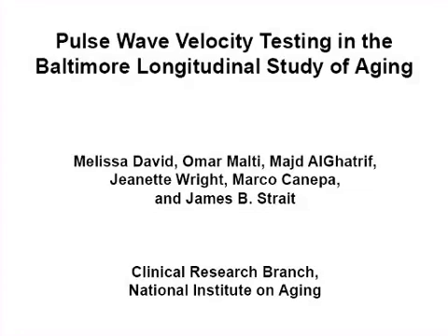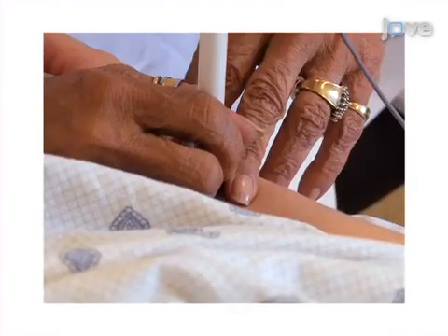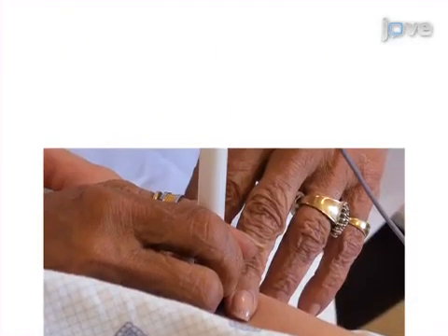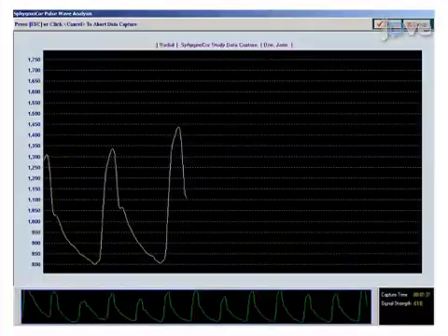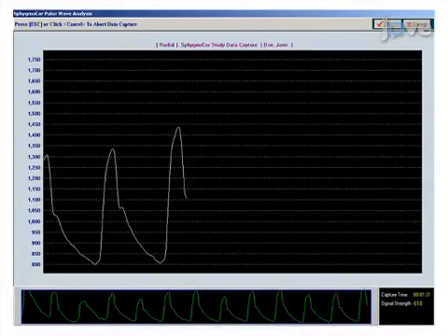The overall goal of this procedure is to assess arterial stiffness through the use of pulse wave velocity measurements. This is accomplished by first measuring the patient's central blood pressure by pulse wave analysis.